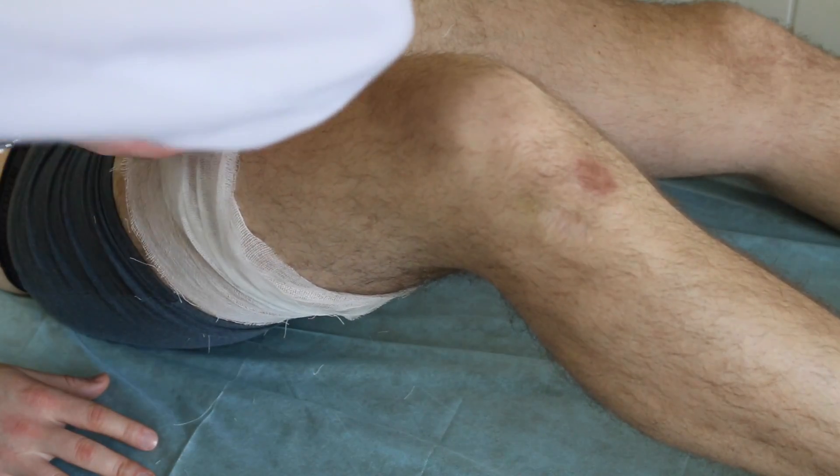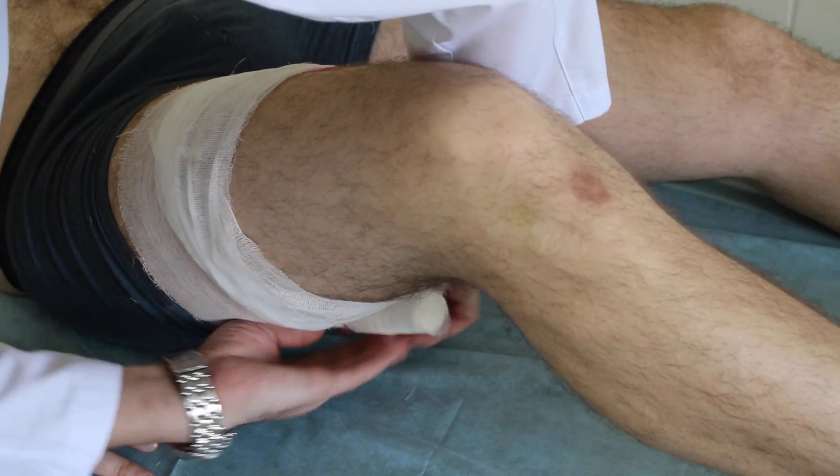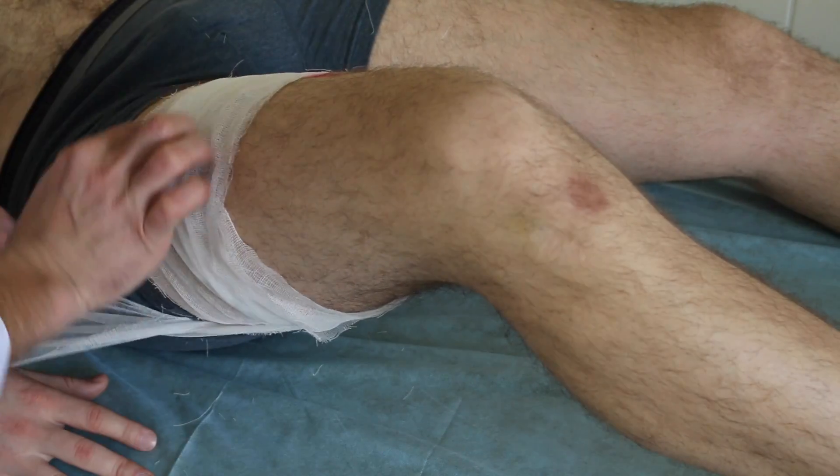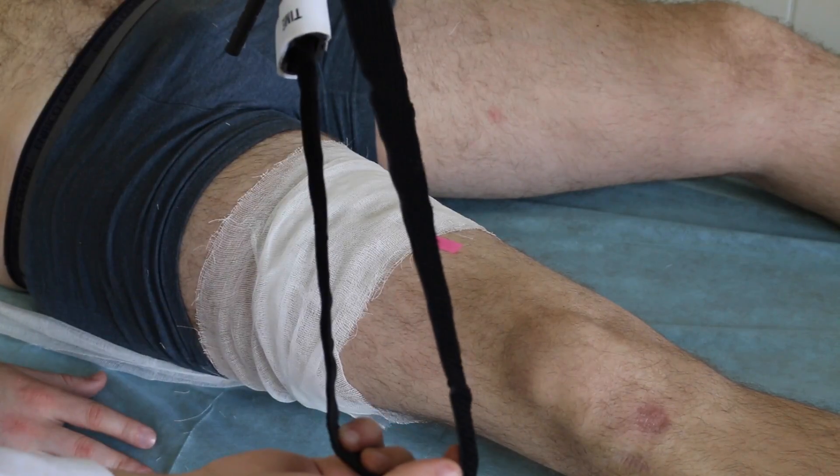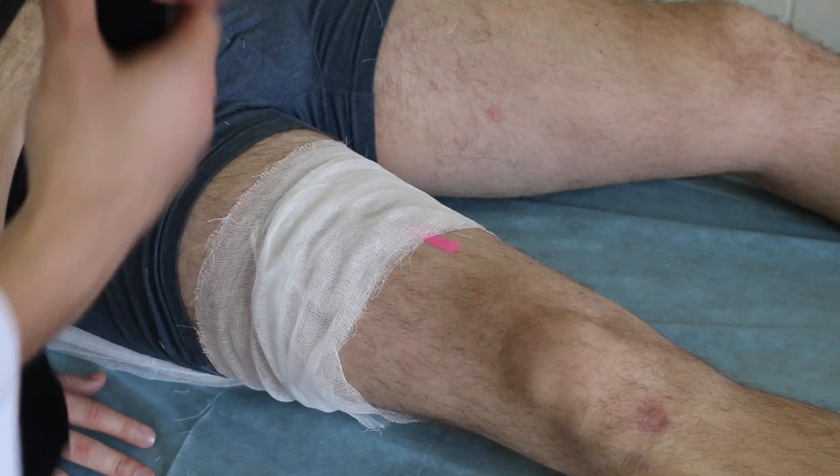Place your tourniquet about 2 to 4 inches away from the edge of the wound. Don't place it directly over the wound, because the arteries upstream from the injury will still drain into and out from the open wound.